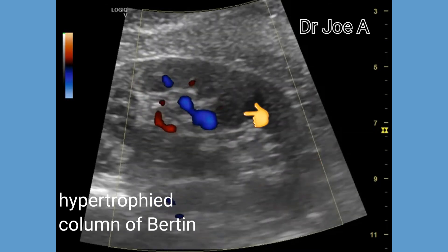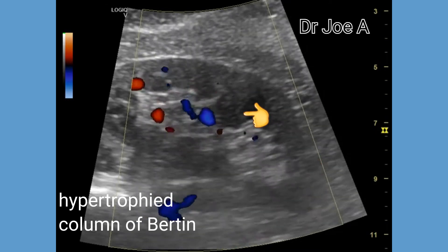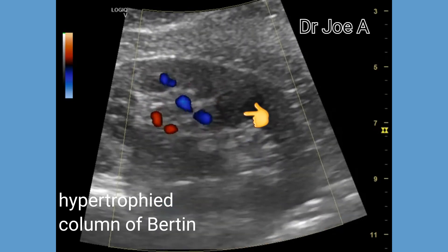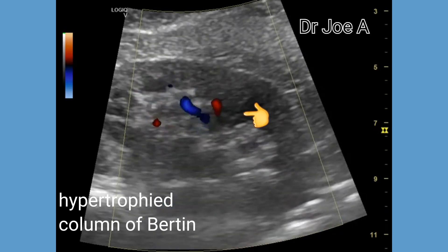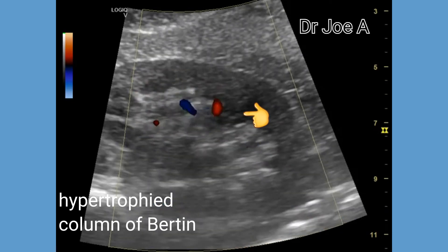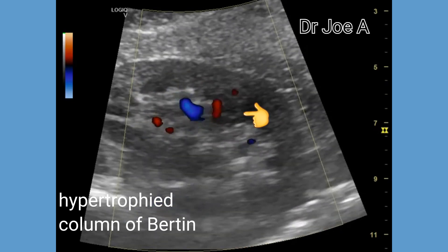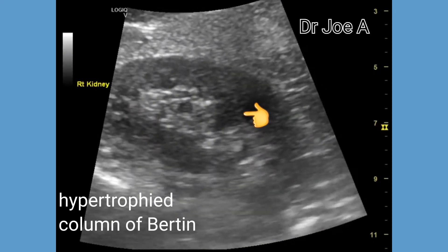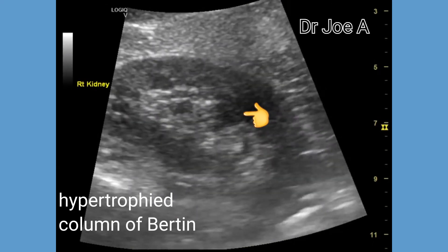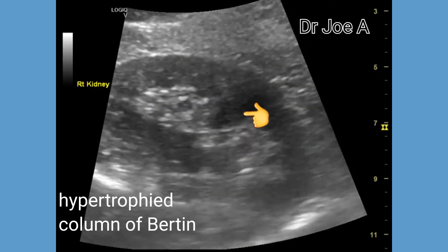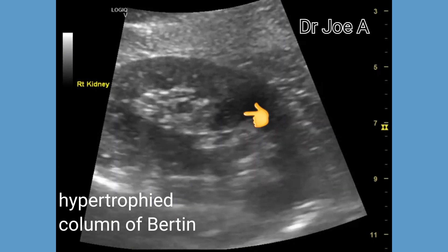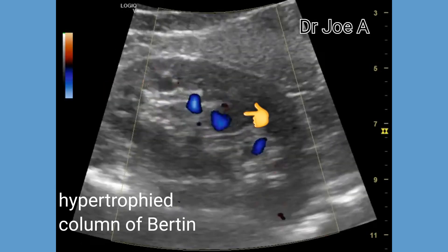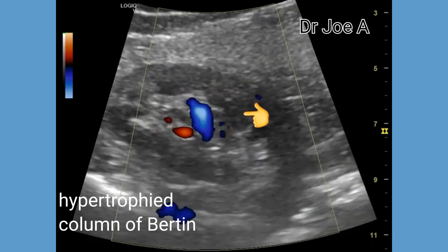Only in rare cases do we need MRI or CT investigation to confirm this diagnosis. The bulge or protrusion into the renal sinus is the hallmark in the diagnosis of a hypertrophied column of Bertin.